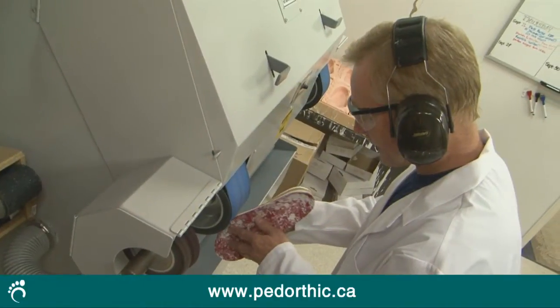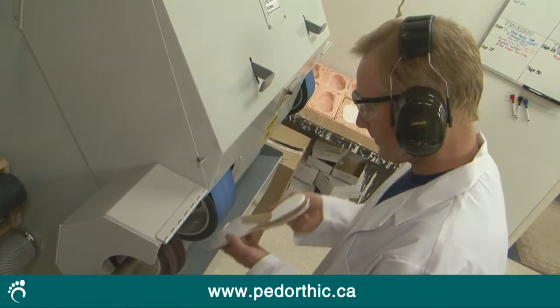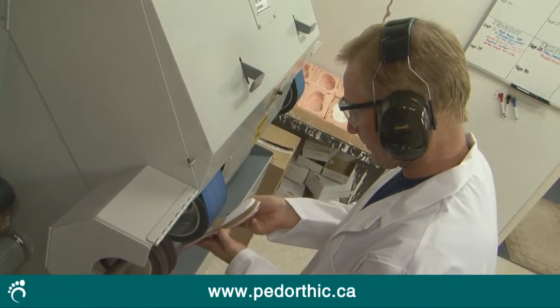After the material is cooled, that shell is taken and trimmed and grinded down to finish the orthotic.